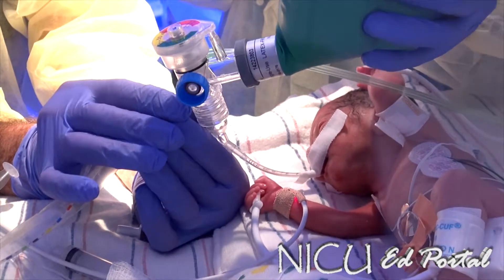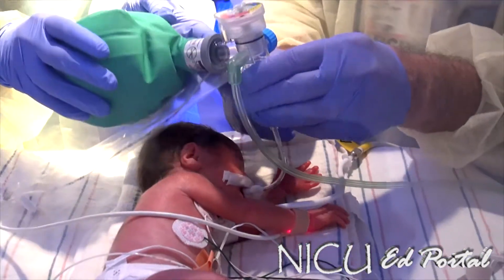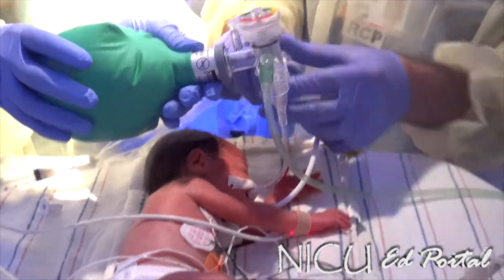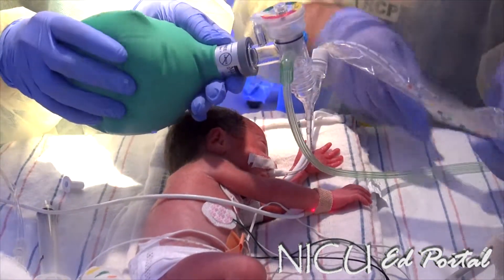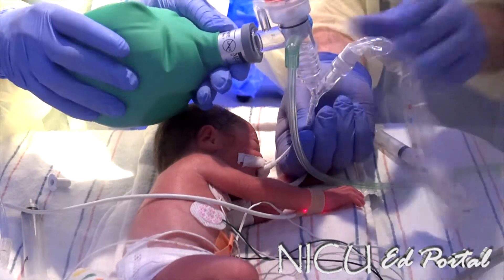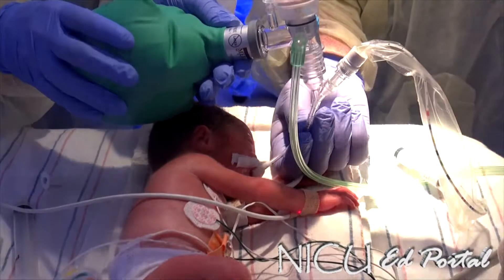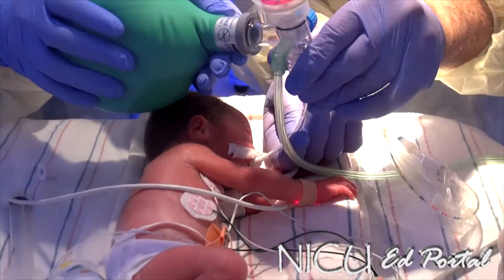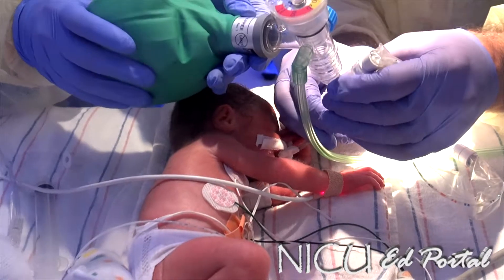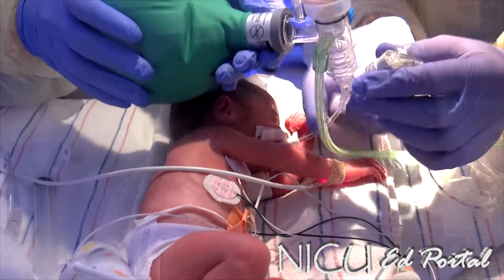Okay, here comes the half dose. We'll probably run this one out. These wires just don't work like they used to. I'm just going to take this off. Yeah, there we go.